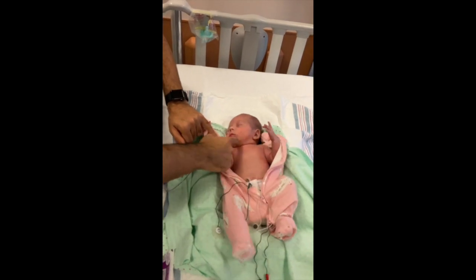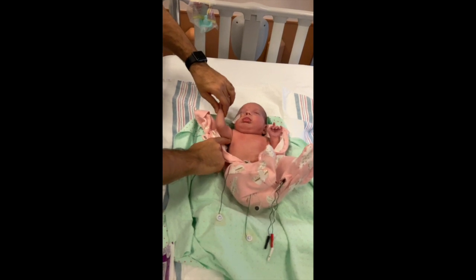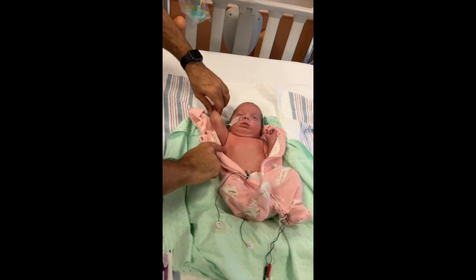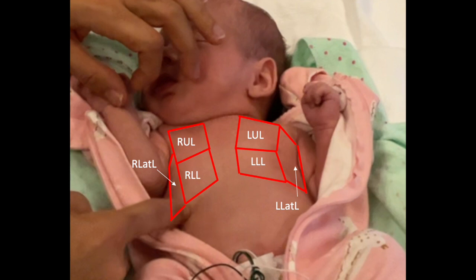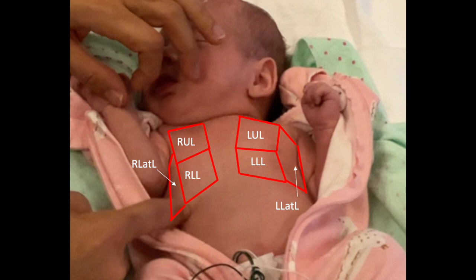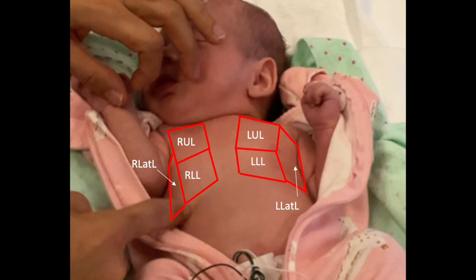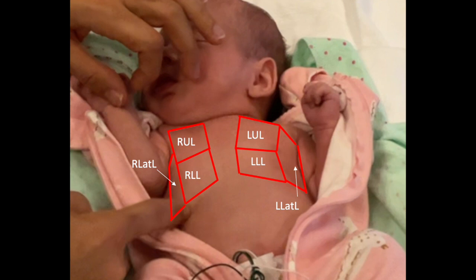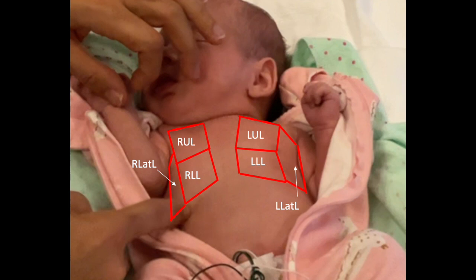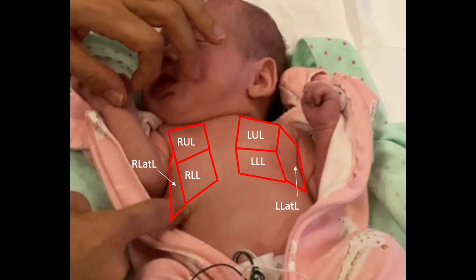We have the upper zones along the mid-clavicular line, the lower lung zone closer to around the nipple line, and the lateral zone around the mid-axillary line. So zones one, two, and three. The right upper zone involves scanning from the clavicular area to the nipple line, the lower zone from the nipple line to the rib costal margin, and the lateral zone from the axilla to the costal margin at the level of the mid-axillary line, where we see the interface with the diaphragm.